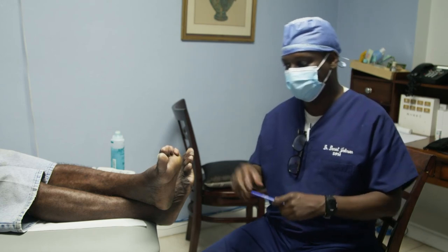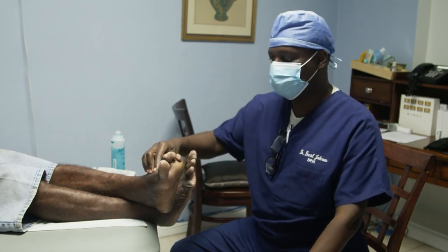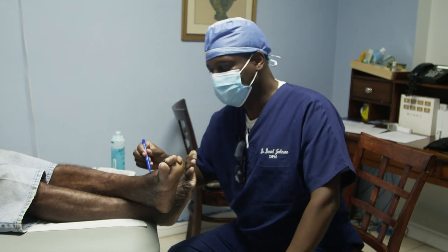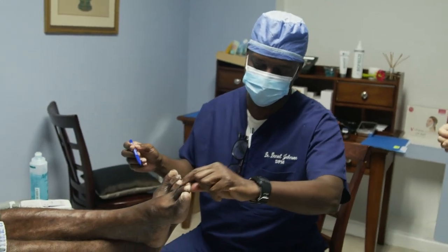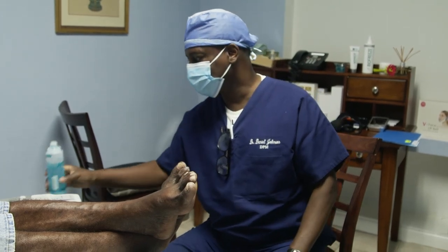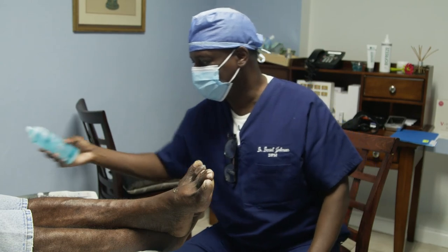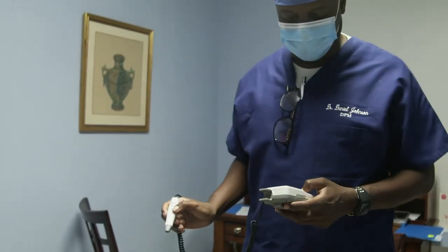So today we're checking a couple of things before he comes in. You saw his blood pressure is good. His blood sugars are good. We're now going to check his blood flow. What Dr. Farquharson was talking about yesterday, the key to this is this large vessel on top here, the dorsalis pedis. We're going to check that before we begin, and we look at his capillary refill. 1, 2, 3, 4, 5, it comes back beautifully. I want to be able to hear whether he has decent blood flow or not. I think he does, but we're going to make sure. Before you do a foot surgery on a diabetic, you want to be able to hear this.